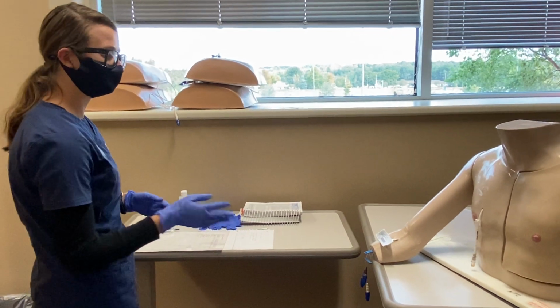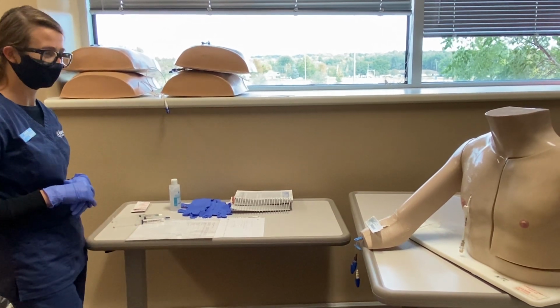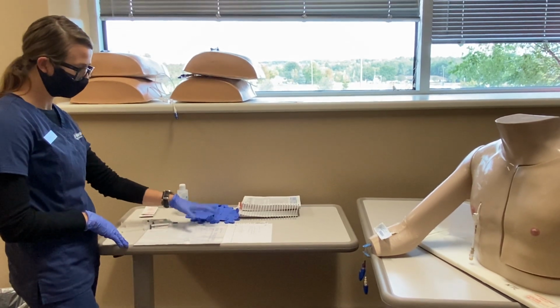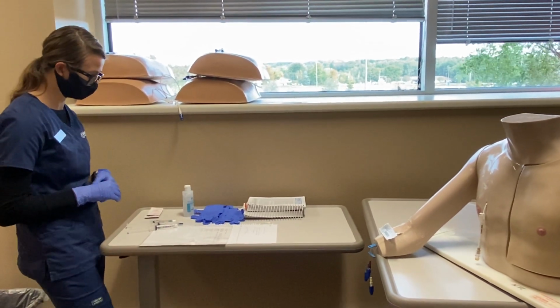I see that you have a central line and you're still receiving chemotherapy, so we're going to go ahead and keep that central line. And you're also having some pain, which is why you're requesting some pain meds. Because you're allergic to morphine, I'm going to be giving hydromorphone today. You don't have to worry, there will be no contraindications.